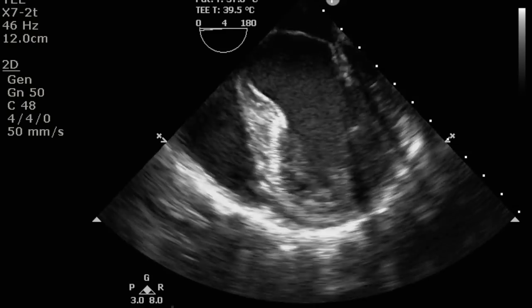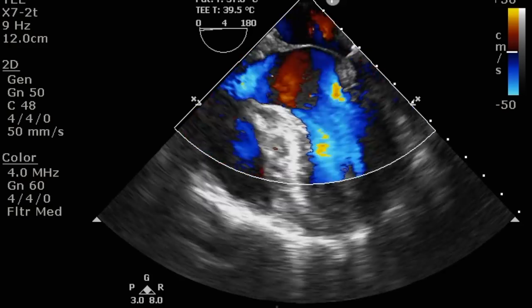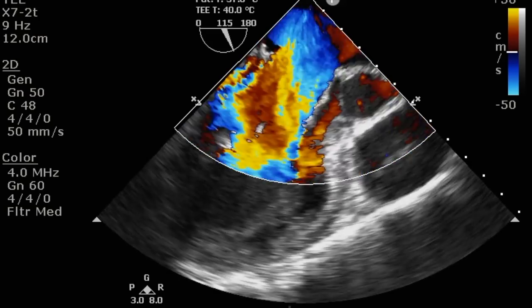After de-airing and removing the cross clamp and coming off bypass, transesophageal echocardiography revealed an excellent valve function without any mitral regurgitation and without systolic anterior motion of the anterior leaflet.